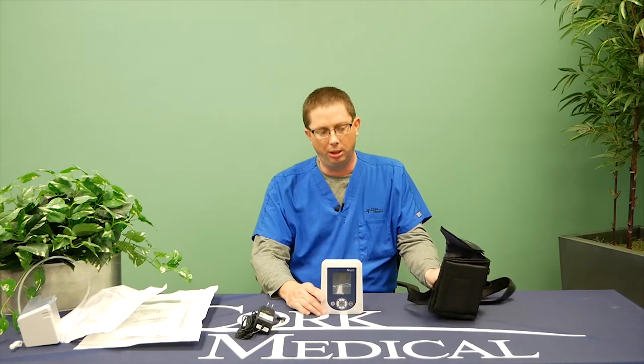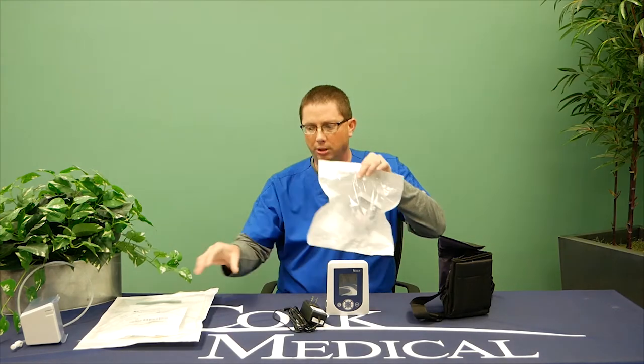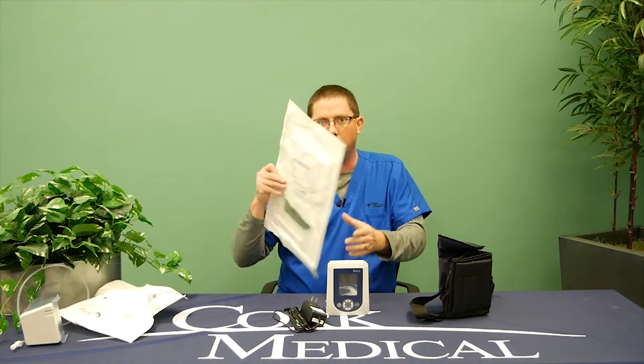When you receive your delivery of your negative pressure equipment, it will consist of a bag, a pump, and a charger. Also, in the box you will have items called canisters, which we'll discuss further, and you'll have items called a dressing kit.